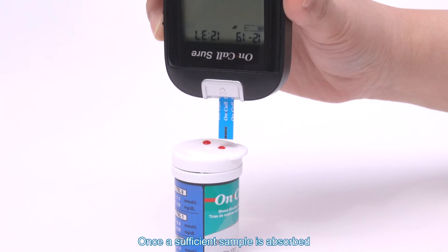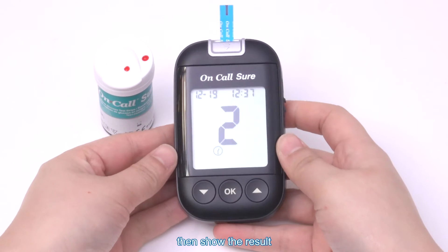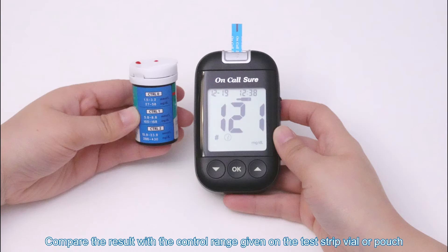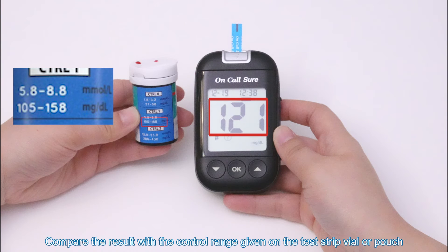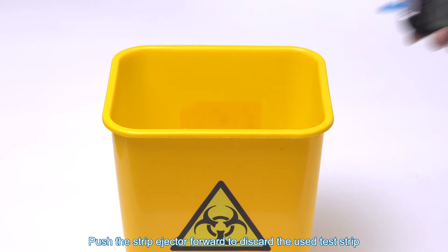Allow the control solution to enter into the tip of the strip vertically. Once a sufficient sample is absorbed, the meter will count down from 5 to 1, then show the result. Compare the result with the control range given on the test strip vial or pouch and make sure it falls within the range. Push the strip ejector forward to discard the used test strip.